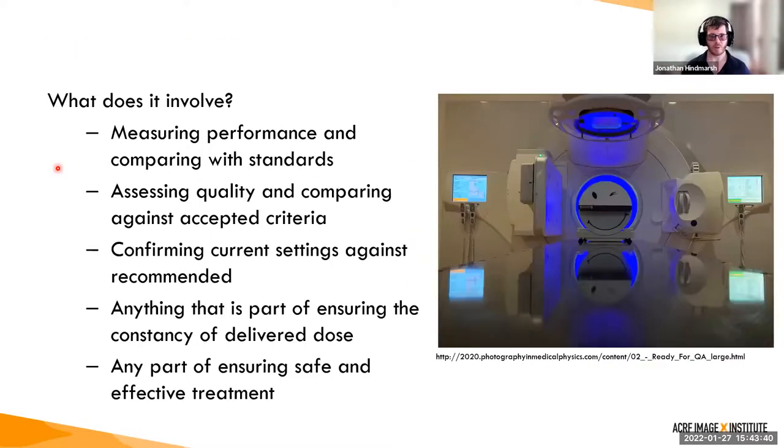And that involves all the components from beginning patient entry to exit and everything the patient sees and does not see. So it's measuring performance of, say, the linear accelerator and comparing against standard fields. It could be looking at the quality of the patient plan. So for patient-specific quality assurance, looking at the patient plan and comparing it against previous plans to make sure that our quality hasn't changed, or that the plan is of equivalent quality to what we've done in the past. A lot of software we use has settings, and those settings can impact the output of the software system. So we need to confirm that we have the correct settings and that they haven't changed on a routine basis. It could be routine, could be up to 12 months.